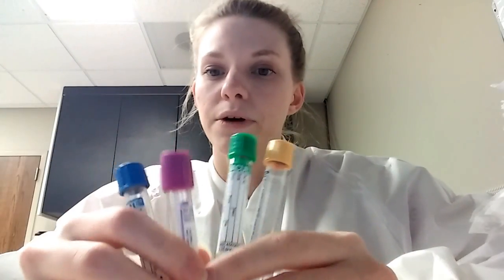I'll start with the rainbow tubes and explain those. The blue top tube, like I said, has to fill up to the line. There are shorter tubes that only have to fill up halfway, but usually when you're using a vacutainer it'll vacuum and pull up the blood the amount it needs to reach that line. The blue tube is normally used for coagulation studies like your pro time or your PTT.